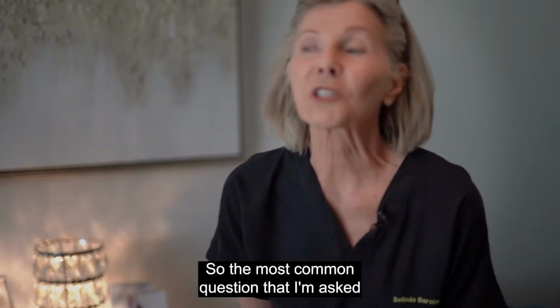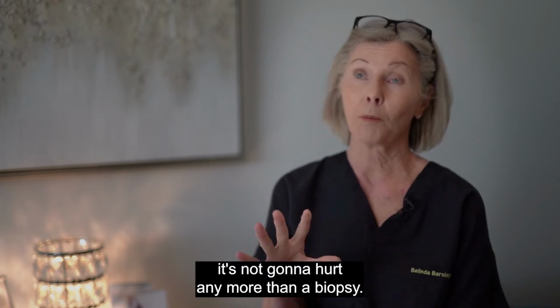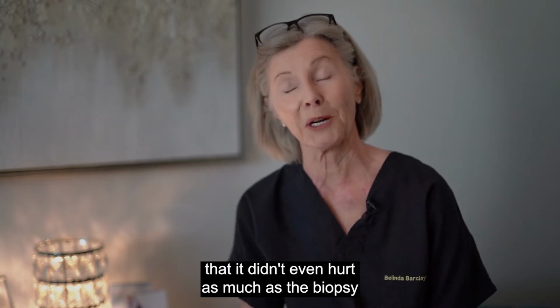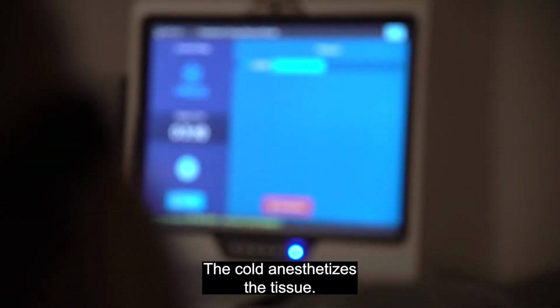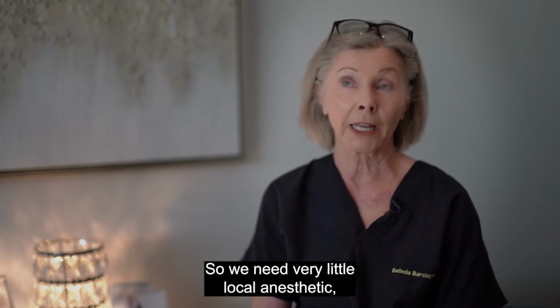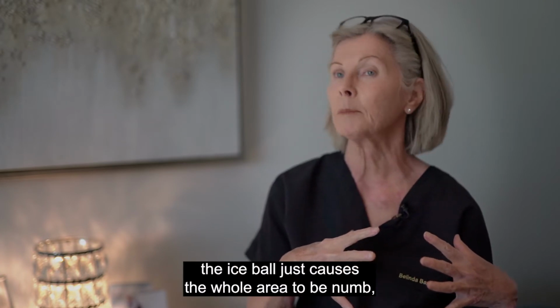So the most common question that I'm asked is, is it going to hurt? And the nice thing is that with local anesthetic, it's not going to hurt any more than a biopsy. And actually, the patient told us this morning that it didn't even hurt as much as the biopsy, because as the ice ball grows, it actually has an anesthetic effect. The cold anesthetizes the tissue. So we need very little local anesthetic just for insertion of the probe. And then after that, the ice ball causes the whole area to be numb.